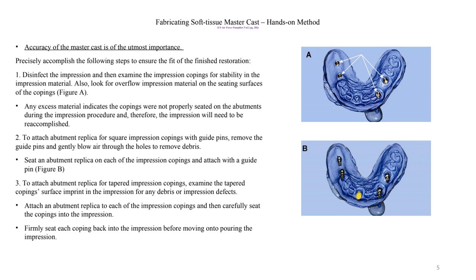Accuracy of the master cast is the most important step. Like every impression that comes from the dentist, we have to disinfect it and then examine the impression coppings for stability in the impression material. We have to look for overflow of the impression material — if there is any impression material inside or around the impression coppings, it will interfere with attaching the replicas. We can use a blade to remove a very small amount of extra material. Any excess material indicates coppings that were not properly seated on the abutments, and therefore the impression will need to be retaken.